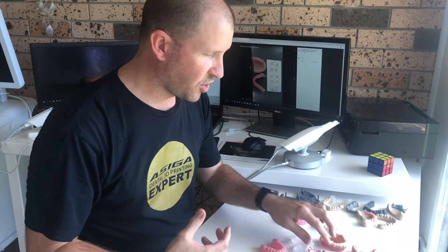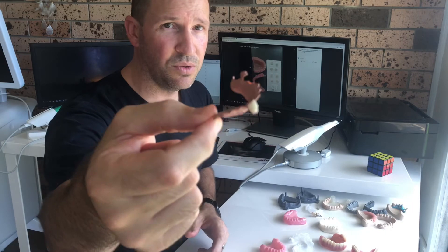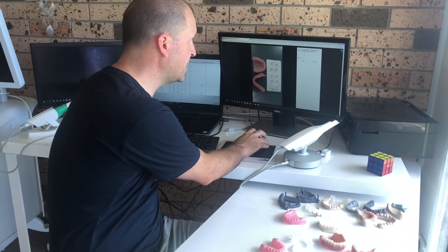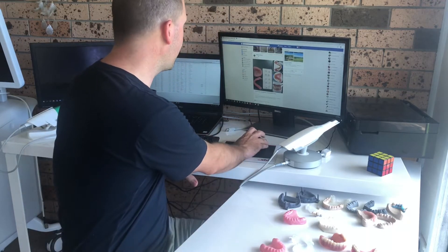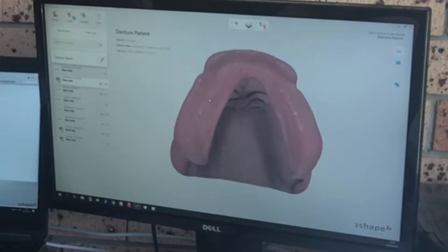Just to show you I'm not fibbing — there's also a digital partial that's been milled out. That's a semi-flexible material called PEEK. We also have another product called acetal that's very similar. So I'm going to jump into the scanner now.